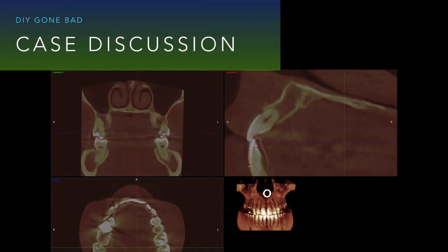So we're in a case where I think a lot of orthodontists probably would have been fine with the pan, and maybe they would have gotten periodontal clearance. Certainly, 3D allowed us a greater opportunity to determine what needed to be done in this type of case.